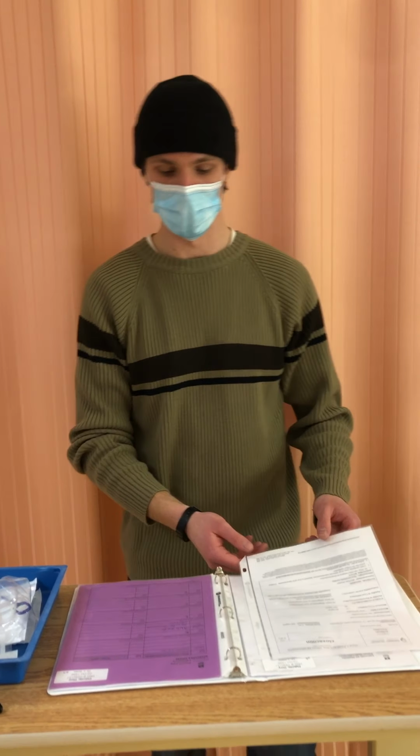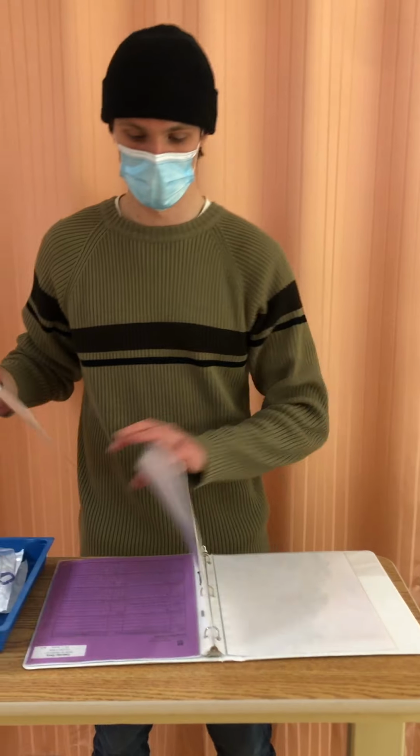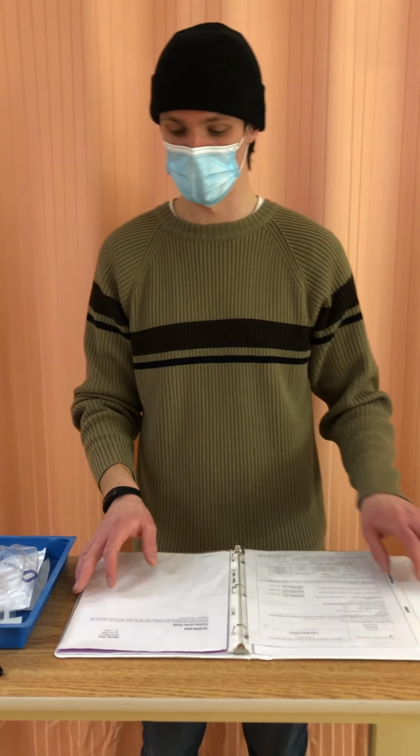My name is Tom. I'm a student nurse, and I'm just going to be demonstrating how to administer medication via IV through a Minibag. So I see here that I have a patient. Her name is Dabna Dory, or Dory Dabney.